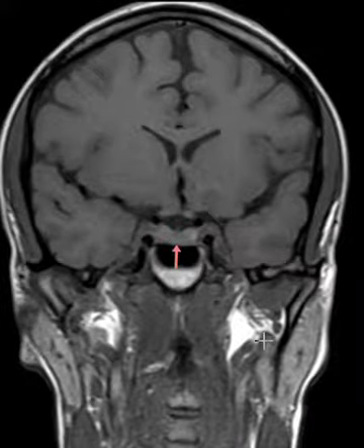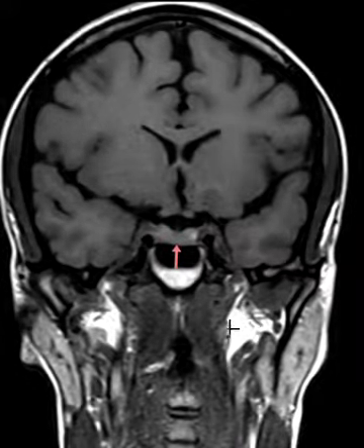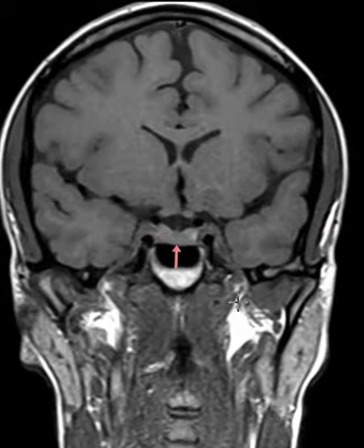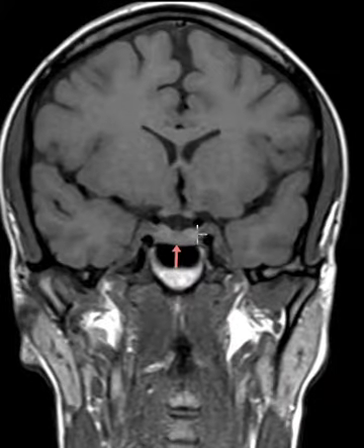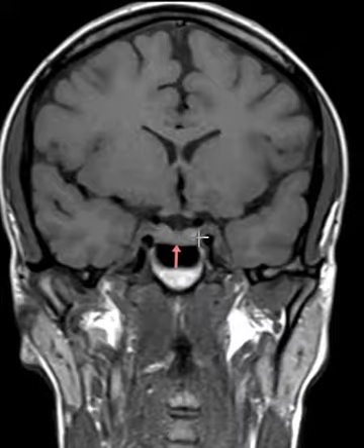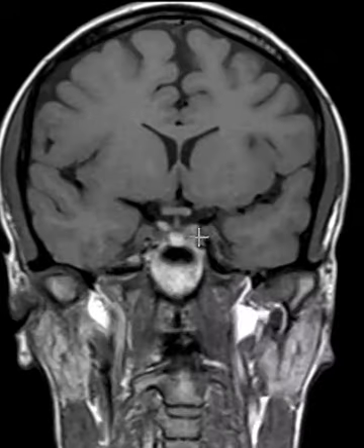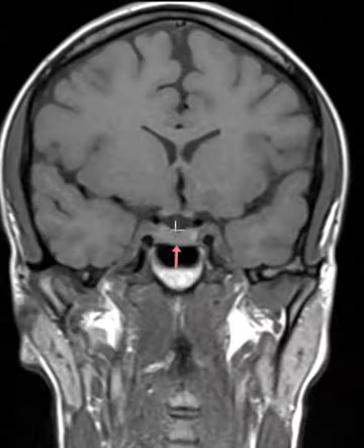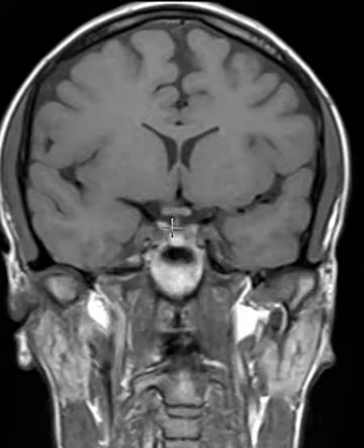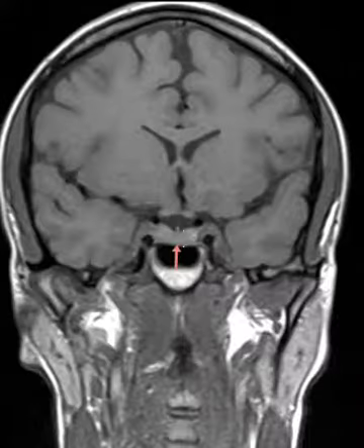Now this is a view where we're looking straight ahead at the pituitary gland. We can see this gray tissue is the pituitary gland — this is the left side, right side — see how balanced it is? The right side and left side are symmetrical. In this view, you see the pituitary stalk coming down into it, nice and midline.